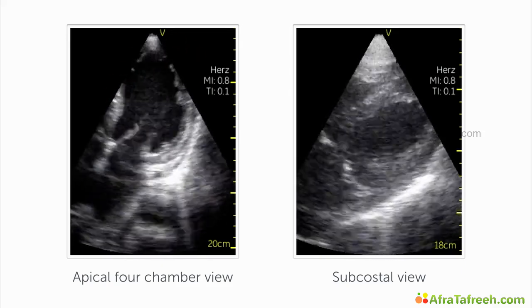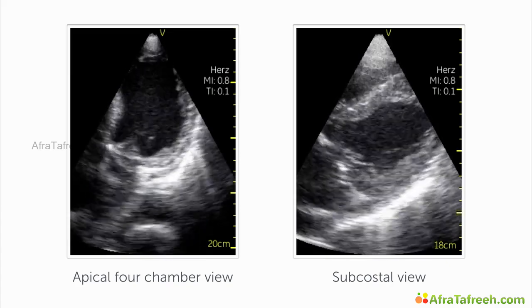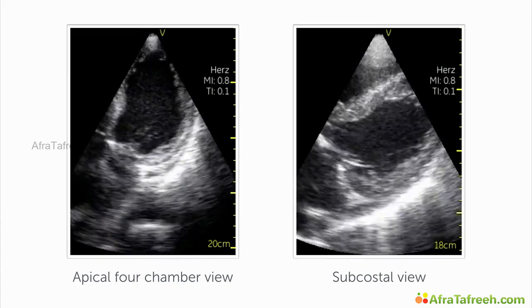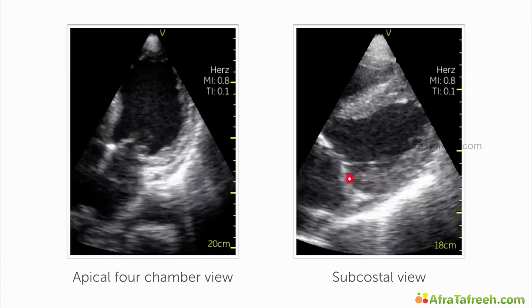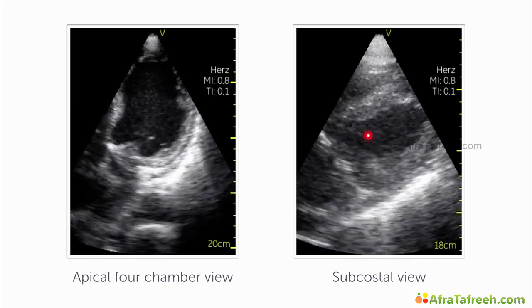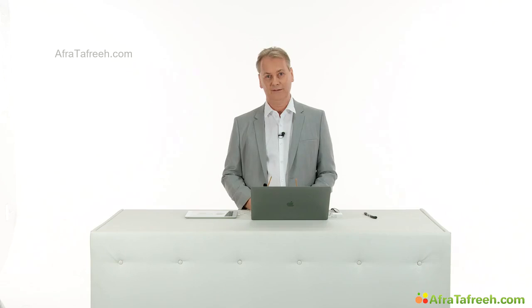Now, this is not a surprise because after all, the patient has hypertensive heart disease, and this is how the ventricle reacts with hypertrophy. You see pretty much the same thing here in the subcostal view, a dilated left ventricle with significant hypertrophy. Now, the diagnosis is clear. He has heart failure because he has long-standing hypertension. Of course, this patient needs further attention and further treatment.